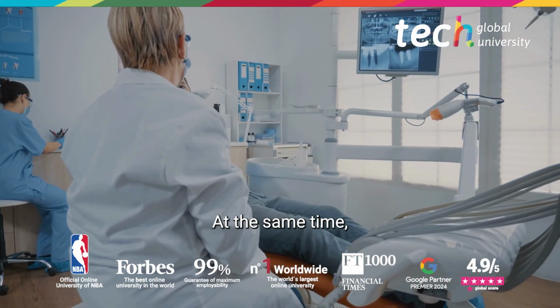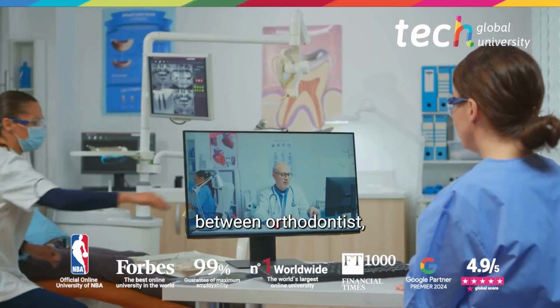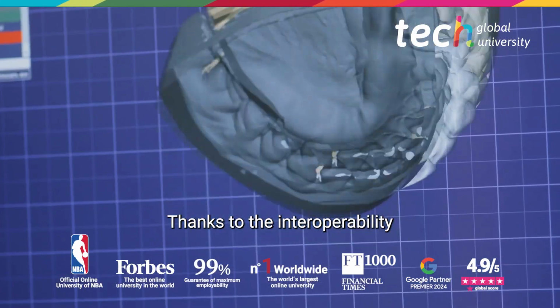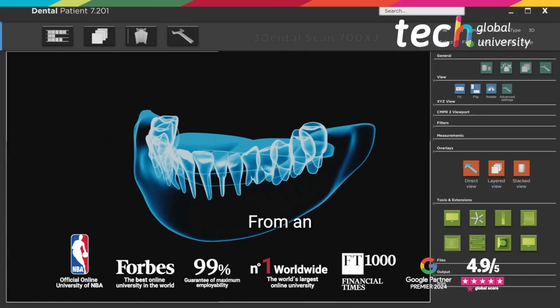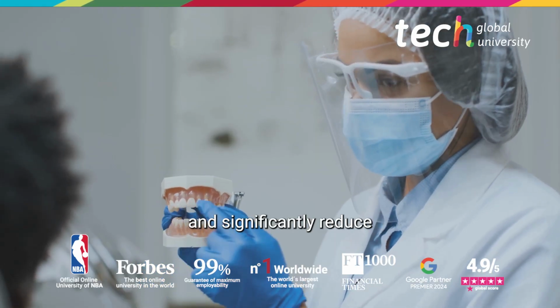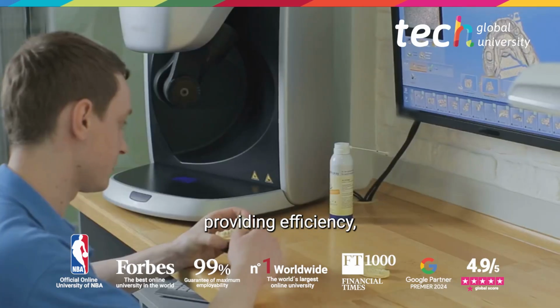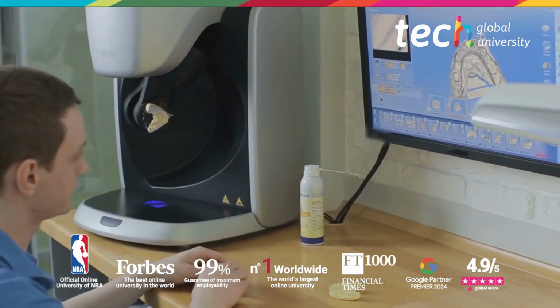At the same time, digital models enhance communication between orthodontist, laboratory, and patient, thanks to the interoperability of standard files such as STL format. From an operational perspective, digital models eliminate the need for physical storage and significantly reduce the use of disposable materials, providing efficiency, sustainability, and traceability.